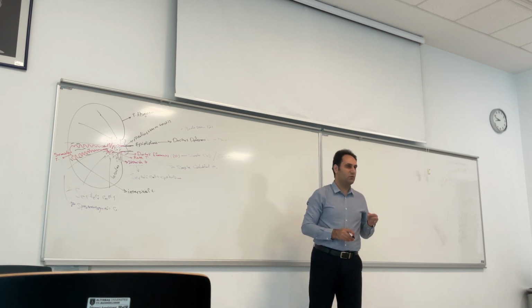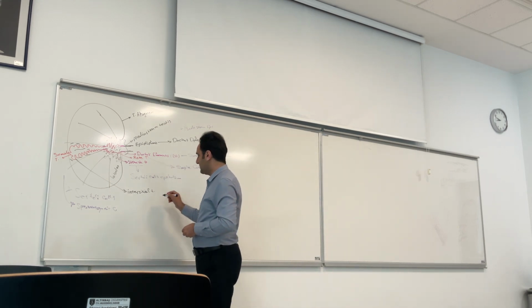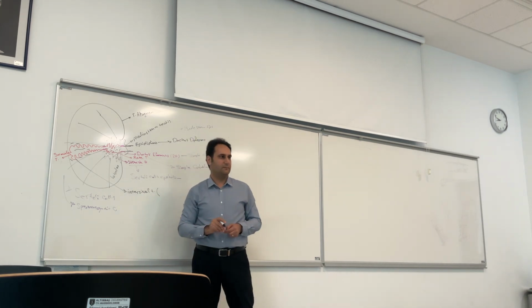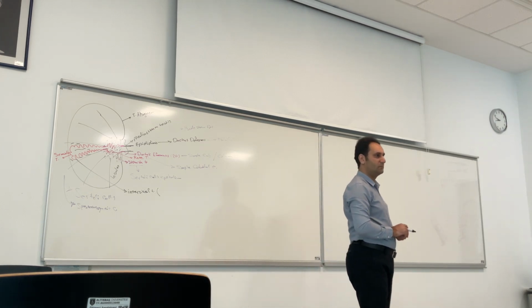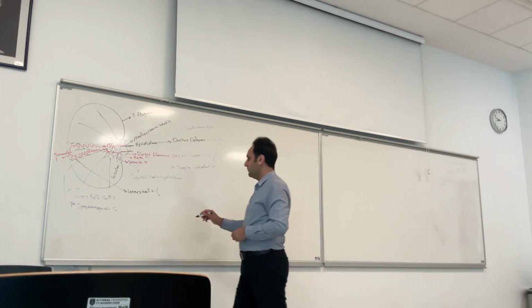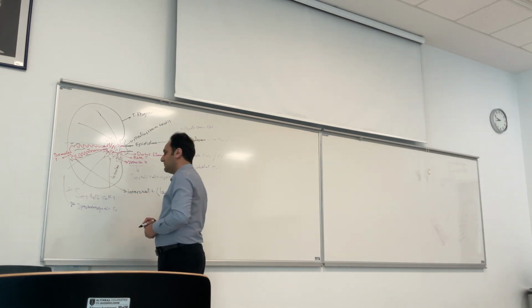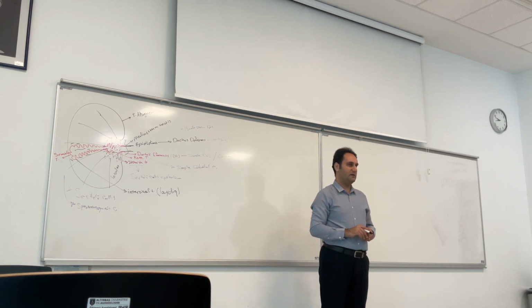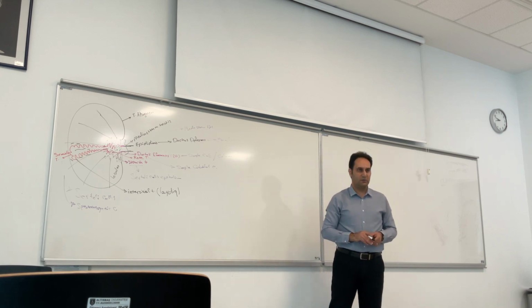And the most important cells present in the interstitial area, the cells which produce testosterone, are the Leydig cells. The Leydig cells have a role in the production of testosterone and dihydrotestosterone.